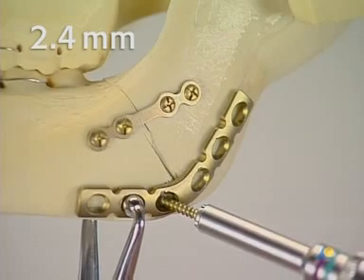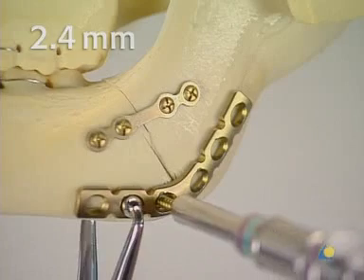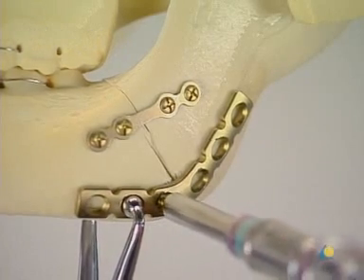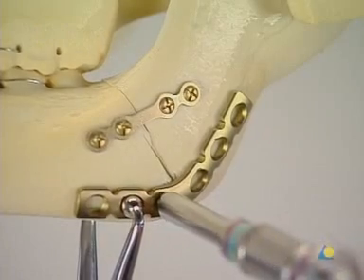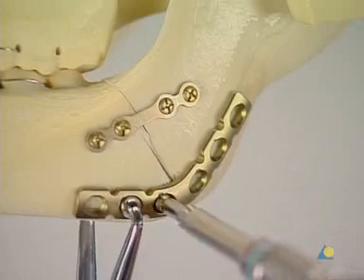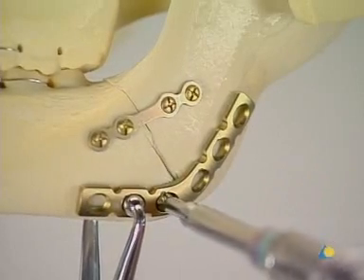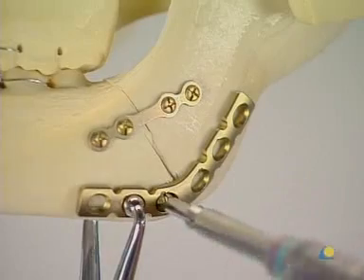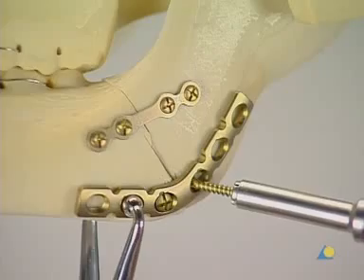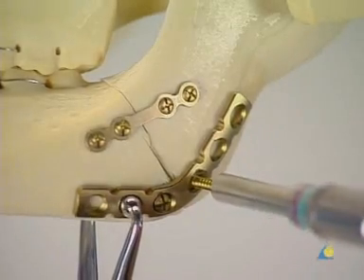A 2.4 millimeter self-tapping screw of appropriate length is inserted. If the bone is very dense, the hole may have to be pre-tapped. Another neutral screw is inserted in the other main fragment at a safe distance from the fracture.